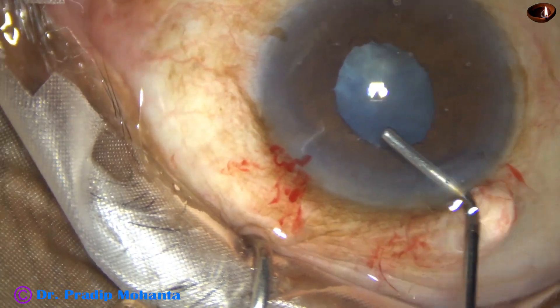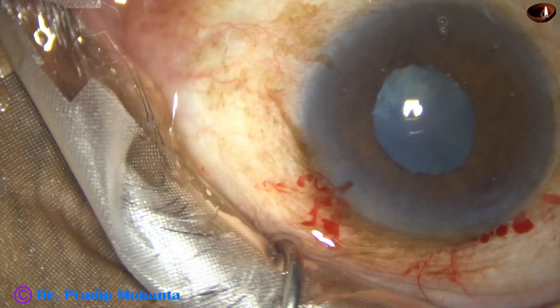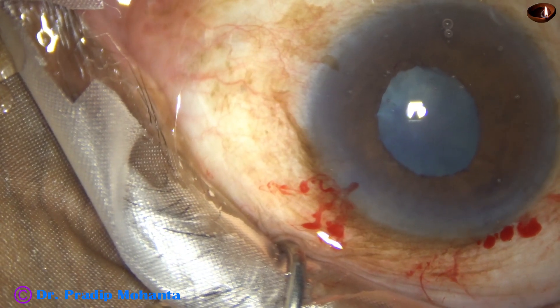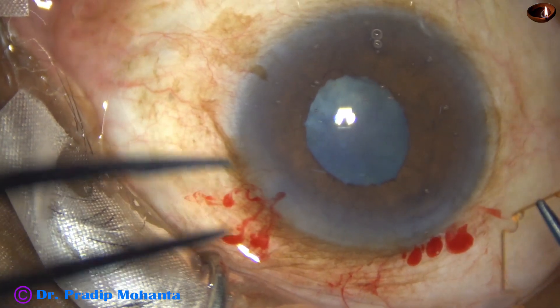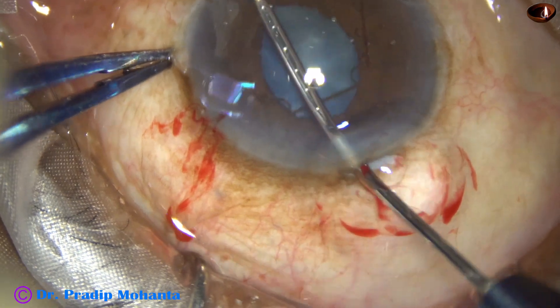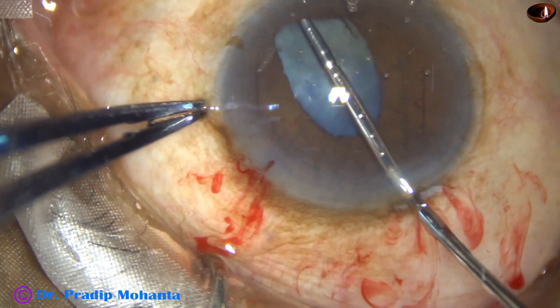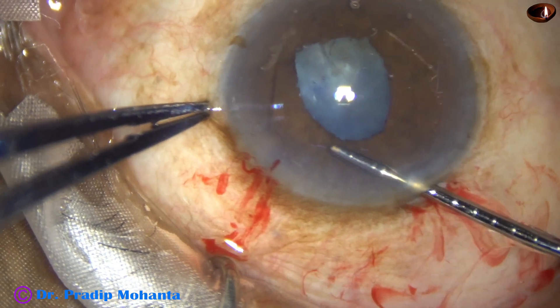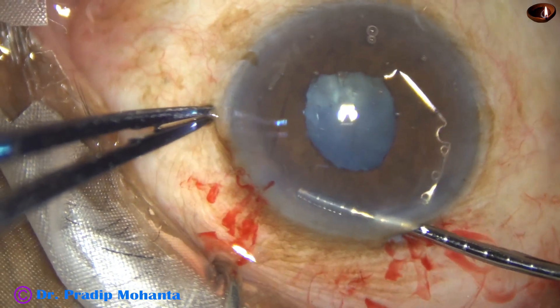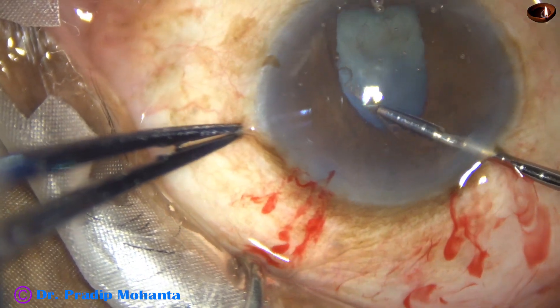The iris has been stretched only once. This is a gentle retraction, gentle stretch of the iris. Now here goes the B-hex pupil expansion device. The leading flange is tucked at 6 o'clock. Go to the left side and hold the flange located at around 1 o'clock and tuck it.